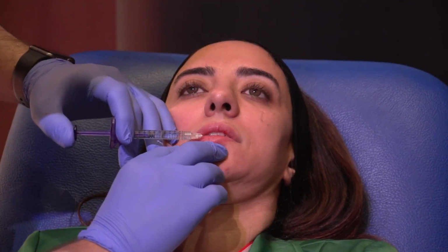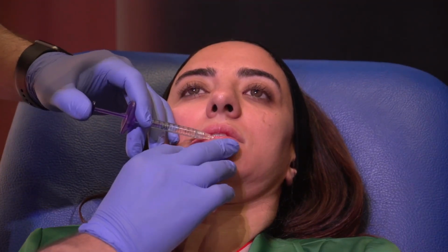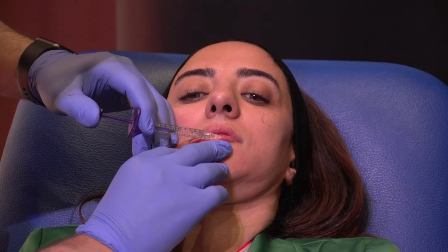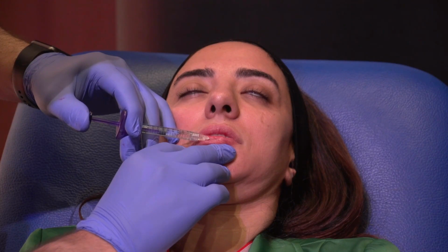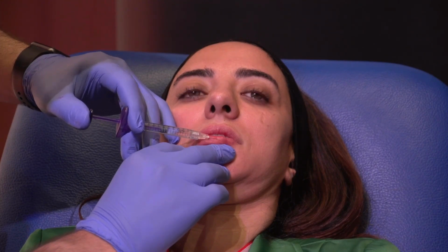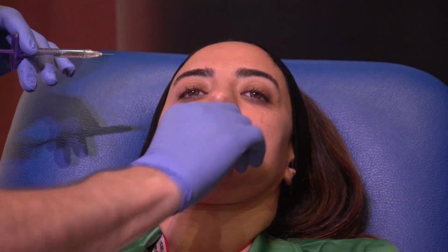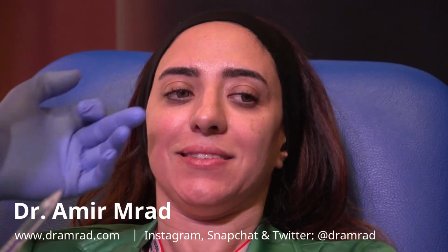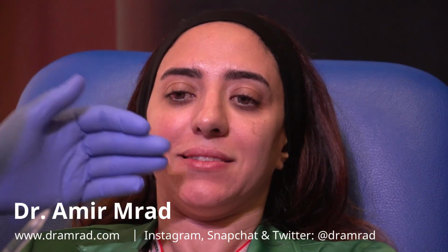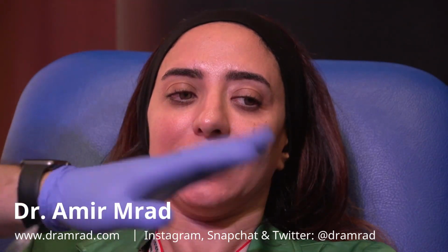Do you use cannulas for the lips? No. Perfect. So no lumps. Okay. Excellent. They might have a little bit of swelling in the site that I've injected initially, and then as you go, you'd see it less. I'd say don't worry about it. The rest will swell in a few minutes.